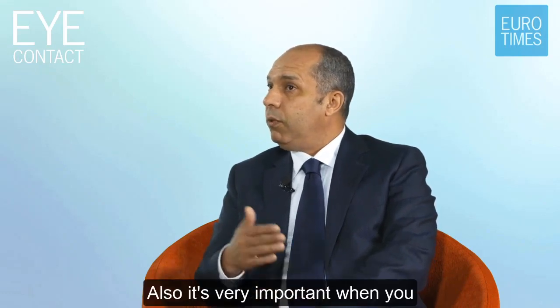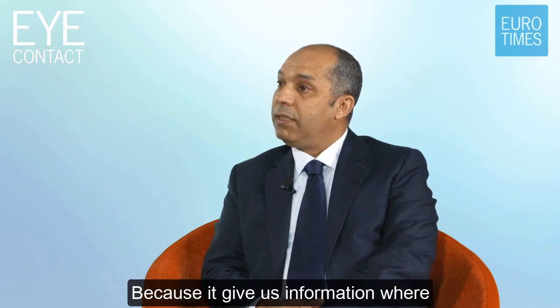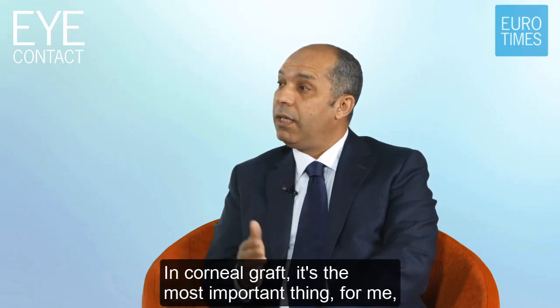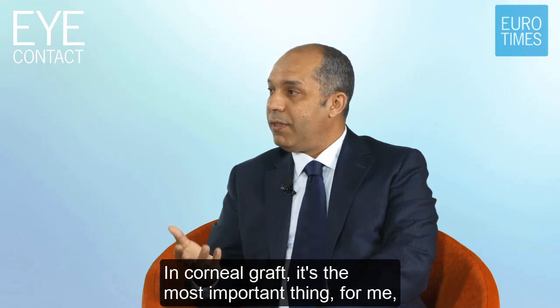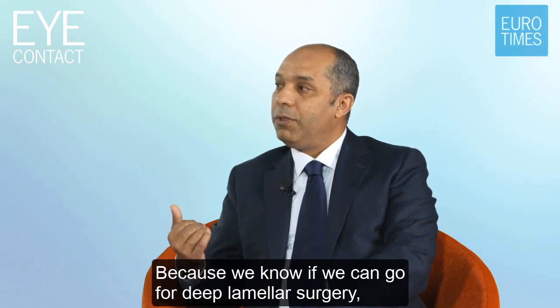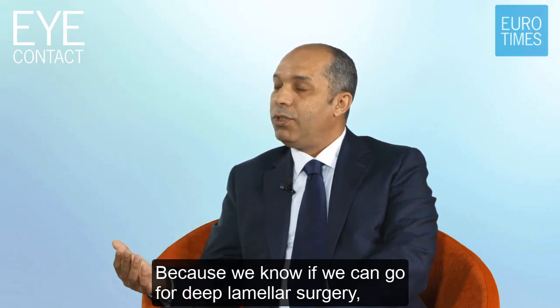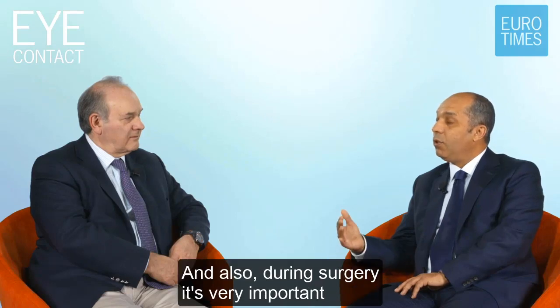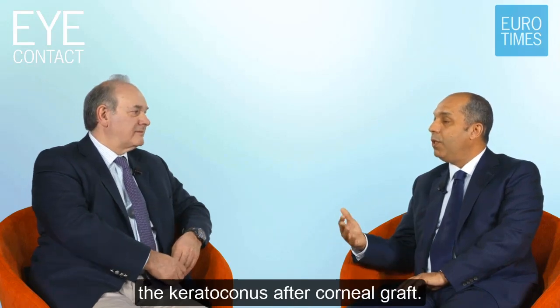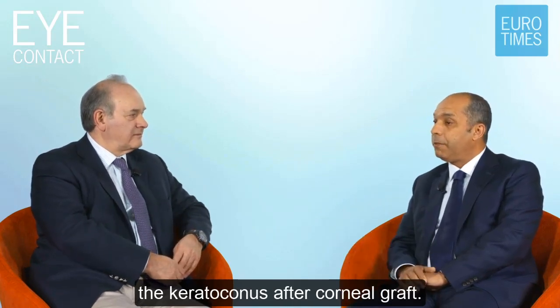Also, it's very important when we are using intracorneal rings, because it gives us information on where we should put our rings and if our rings were very well placed. In corneal graft, it's the most important thing for me for OCT, because it gives us information before surgery, because we know if we can go for deep lamellar surgery or penetrating surgery. And also during surgery, it's very important, and we will talk about that. Finally, the OCT is very important to follow the keratoconus after corneal graft.